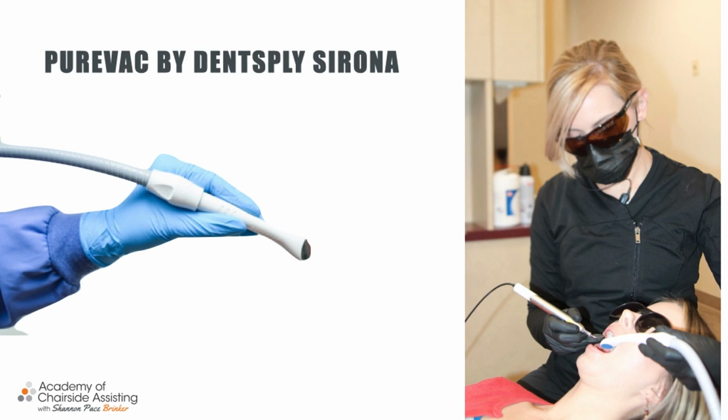The other thing is that it is a little bit heavier than your metal mirror. And listen, that is not something Dentsply can control. Anything that's going to be hooked to a hose is going to be heavier than something where you're just holding a metal instrument. So you can't compare that. This is one of the things I see a lot: it being compared to an instrument. And that's not fair to Dentsply, because it's not the same.